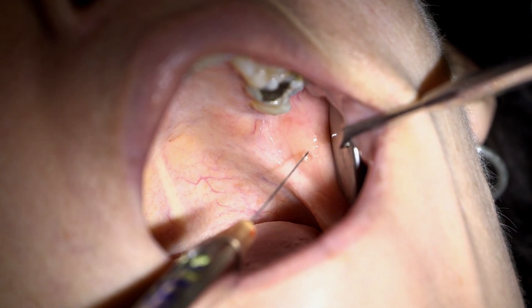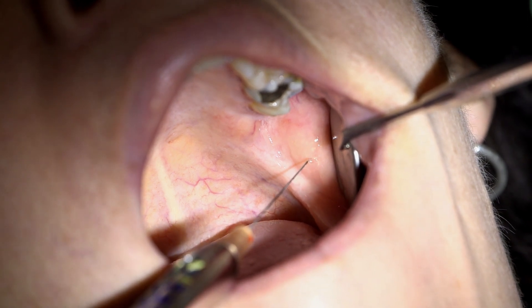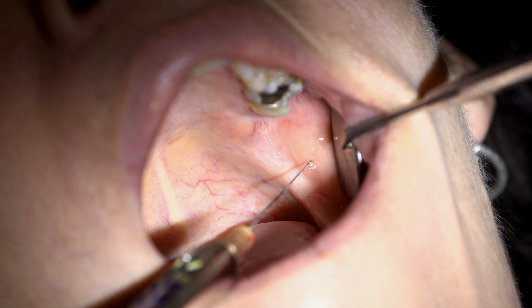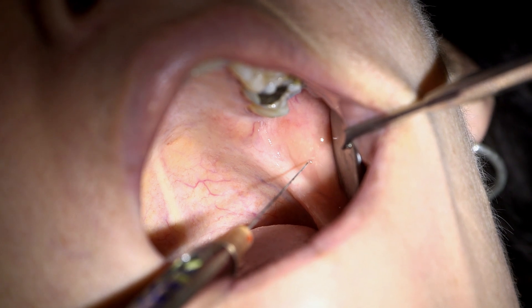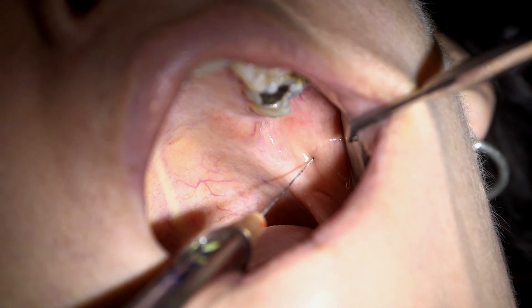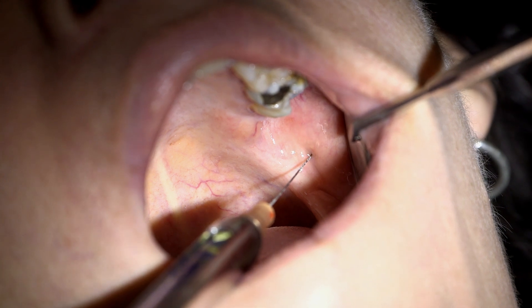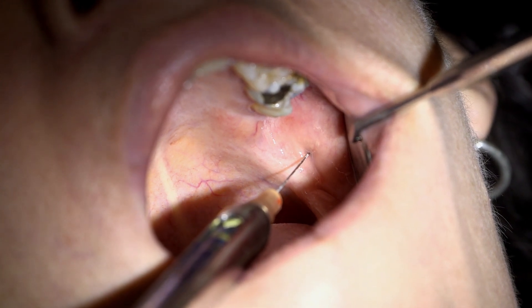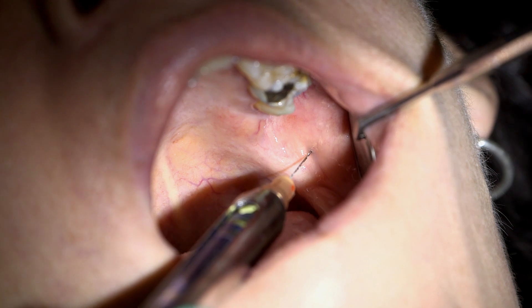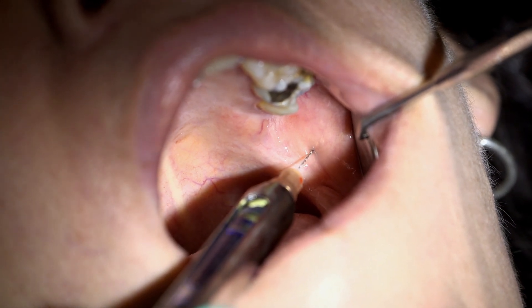The height is determined by the coronoid notch and the deepest point of the raphae, and is usually 10 mm above the occlusal plane. Insert the needle 20 to 25 mm, usually two thirds to three quarters of a long needle. There should be no resistance until you gently contact bone.